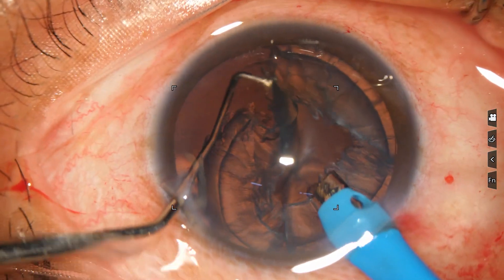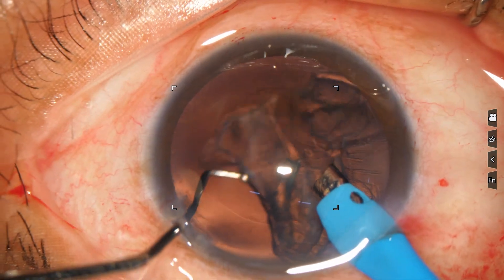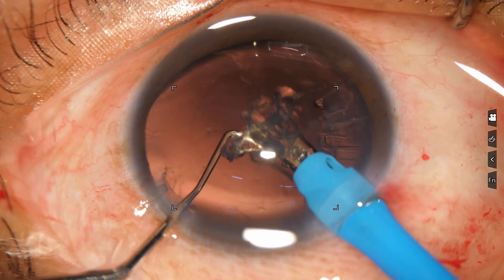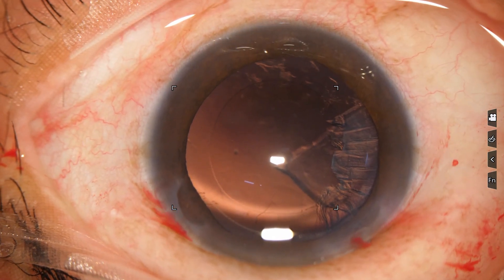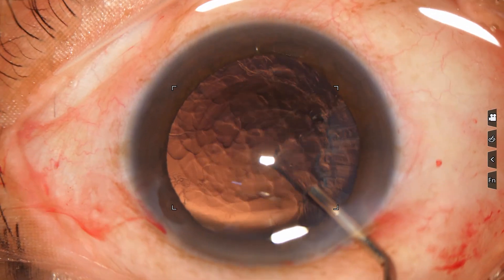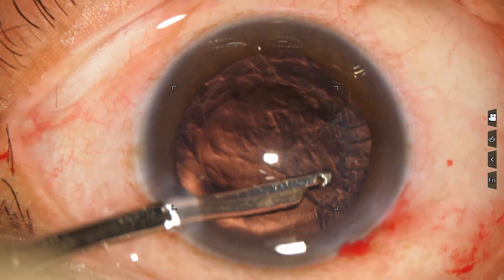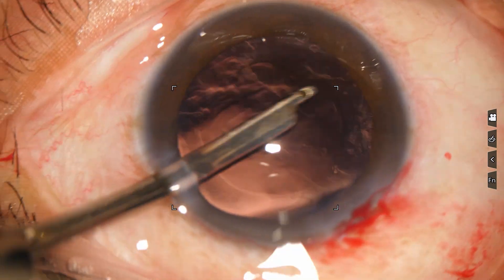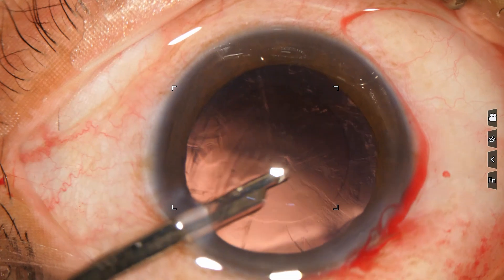Now I am removing the epinucleus. Most of the cortex has been removed, and now a bit of cortex remains from 8 o'clock to 11 o'clock. Viscoelastic is used to fill up the anterior chamber. The Simcoe goes through the side port and the remaining cortex is removed.